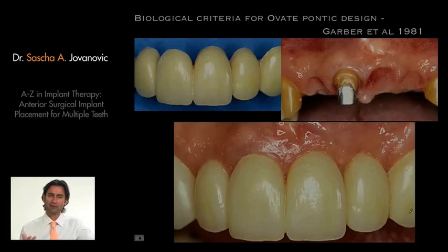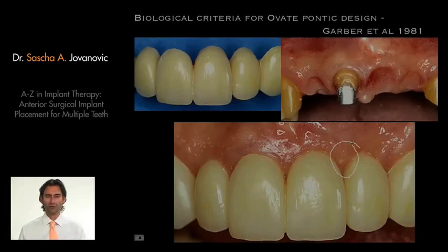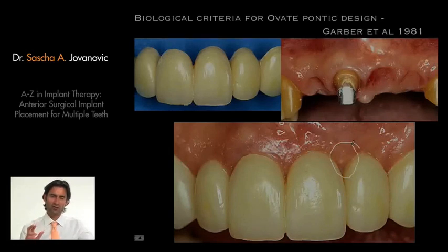And you can see here that pontics can really give this full gingival emergence. They can even give an aesthetic illusion of having a papilla there. Although there's no implant, there's no tooth there, nothing. It's just a restoration. And we're going to be using this in implants today, if we have the chance, to bridge aesthetic areas where more than two teeth are missing, to give the illusion of a gingival profile.